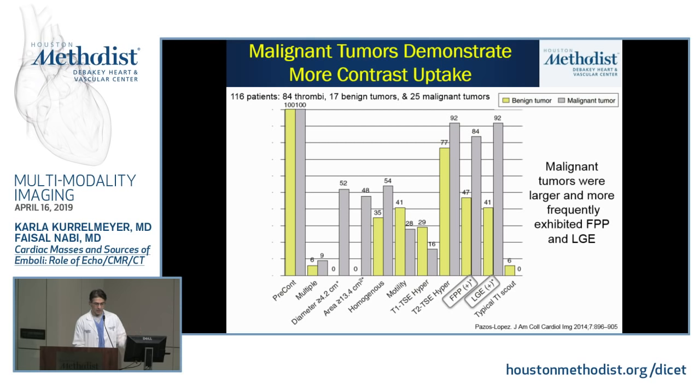And this is really what this one study looked at, also trying to differentiate benign and malignancy. You can see all the values are really intermediate. It's hard because both tumors, whether benign or malignant, all take up contrast.